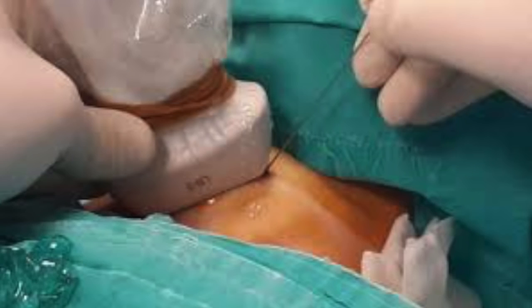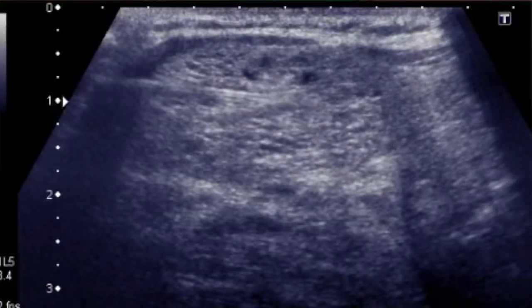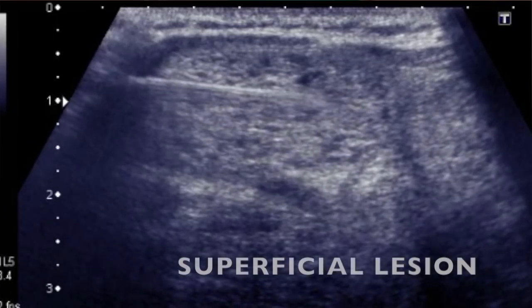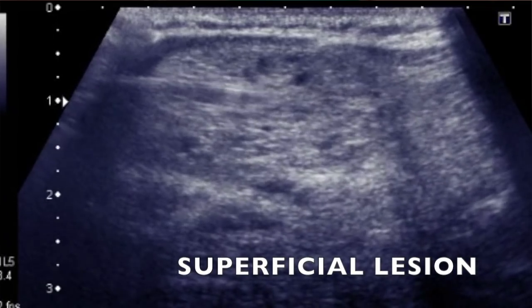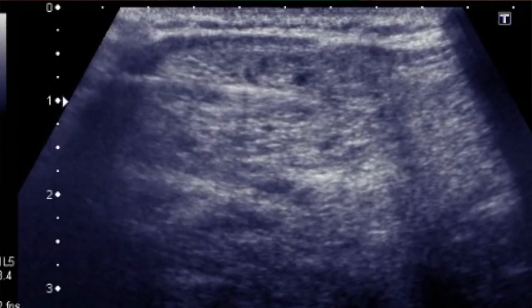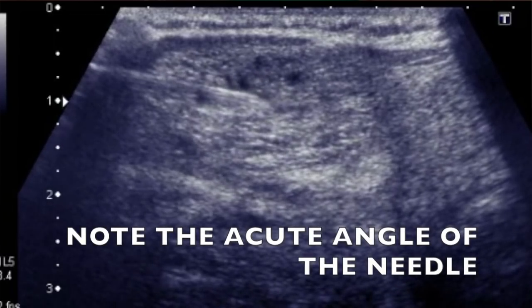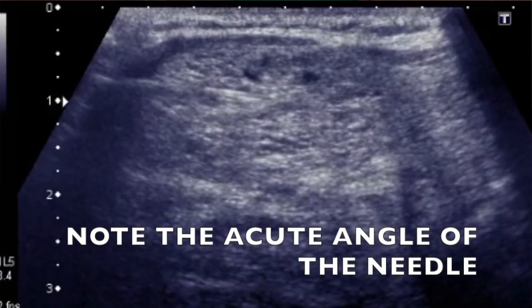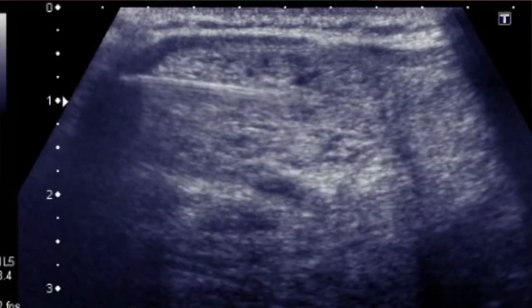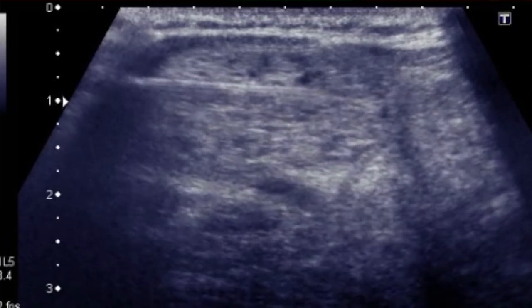For superficial or small lesions of 4, 5, or 6 mm, FNA can be difficult. Use a shorter needle (1 inch) and keep the insertion angle shallow so you get maximum needle length inside the lesion. Exactly the opposite approach — a steeper angle and longer needle — is used for deeper and larger lesions.